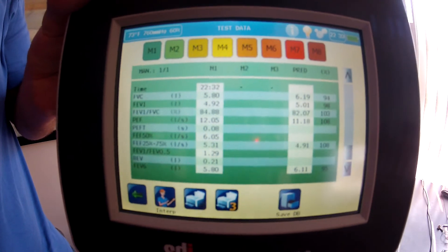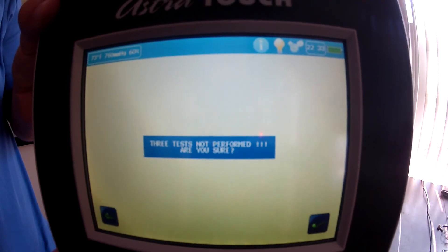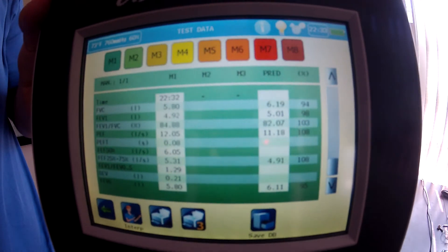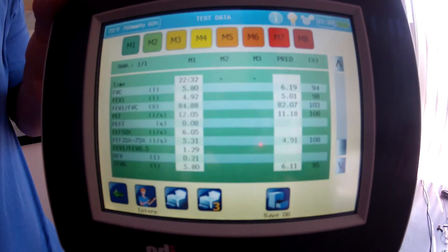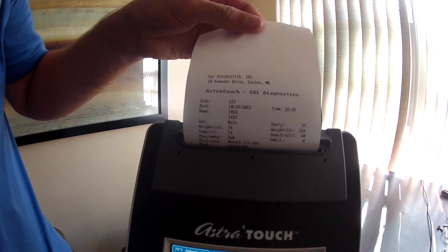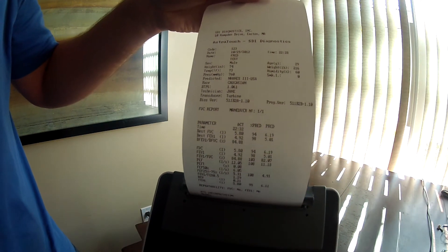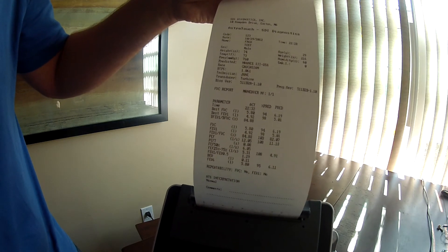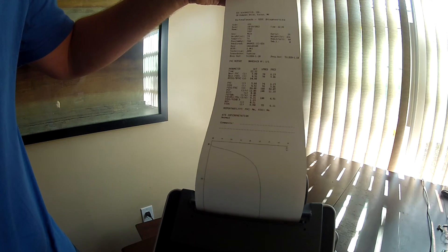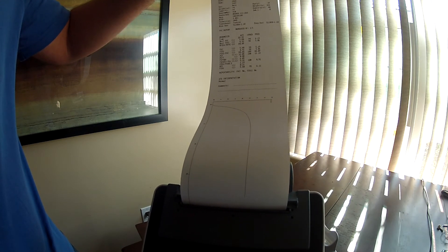You can save it to the database by pushing this button — it's going to save Maneuver 1. Accept. Three tests were not performed; are you sure? Yes. It's not required that you do three tests on this machine unless you're doing occupational health screening. So it's saved to the onboard database. Now I'm going to print it out by touching this button. You can see it's starting to print the test results. You can scan this into your EMR system, or you can connect the spirometer to your computer with the included software and it will convert the results to a PDF document which you can then import into your EMR.